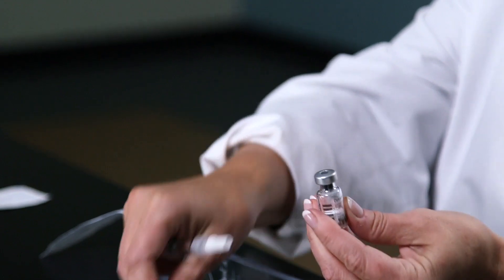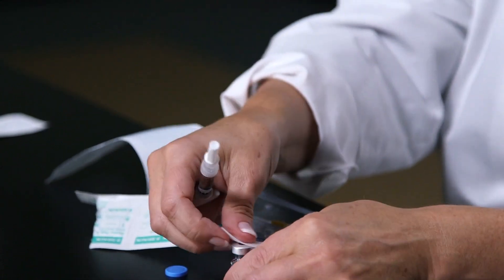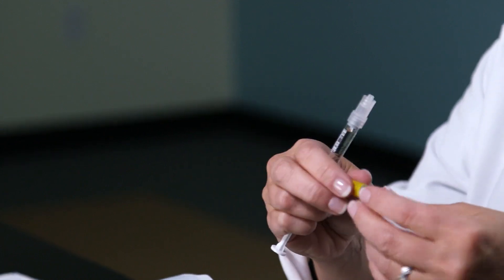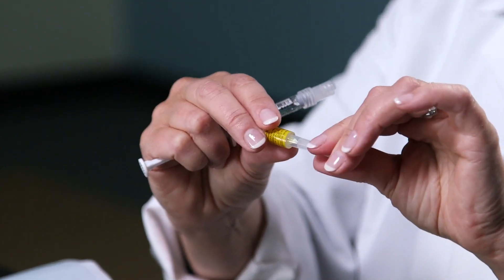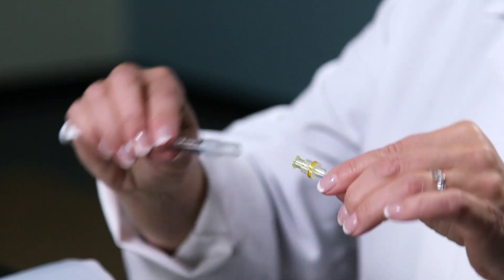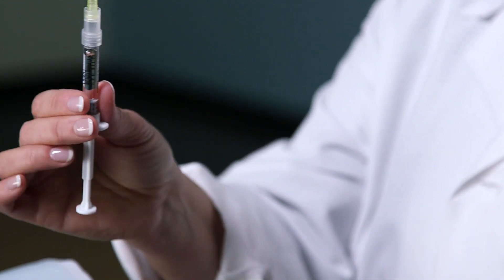I'm going to flip off the cap of the Cetrotide powder medication and alcohol wipe the top. I'm going to pull off the cap for the syringe. This long needle has a paper wrapping around the top of the needle — hold the cap by its base and twist the top to open. Screw the long needle onto the Cetrotide syringe. It will expose the needle. This is for mixing purposes only.